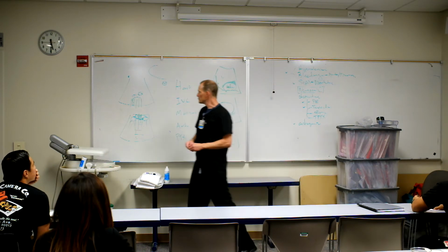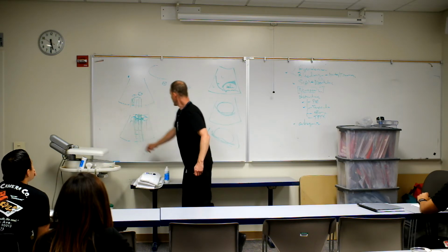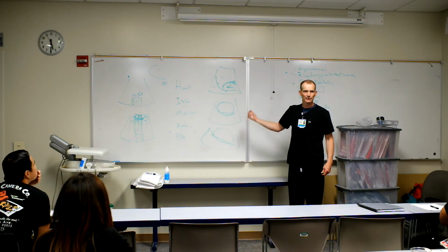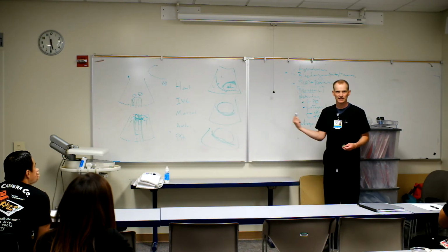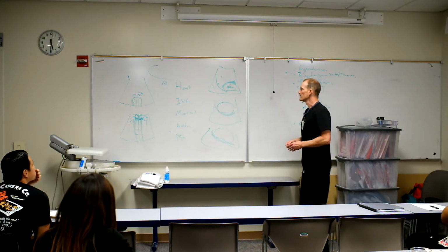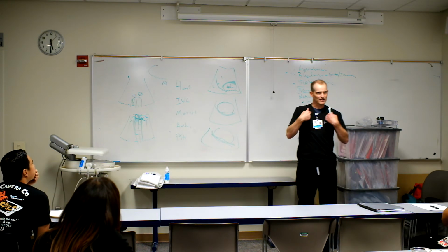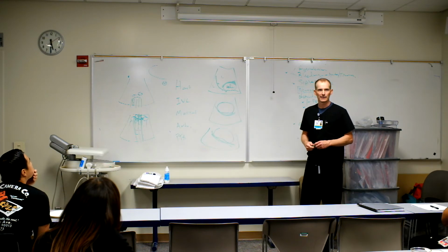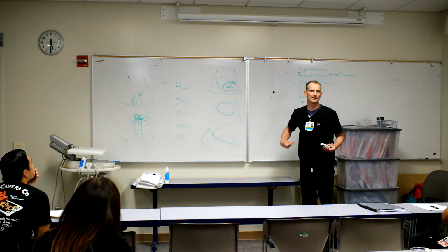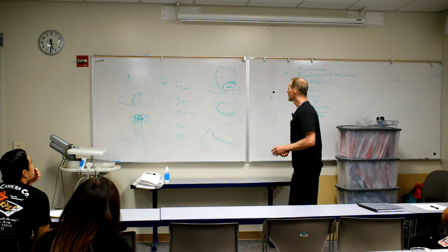But if you do see the B lines, like this, and a big fat left ventricle, then that's your left ventricular cardiogenic shock, right? So that's something else you'll be looking for. So B lines or the pneumothorax. You don't need to go hunting this way or anything. Just if you see it, they're shocky, then go ahead and either stick a needle in. Probably it's better just to stick a knife in and stick your finger through. Okay. All right. So.